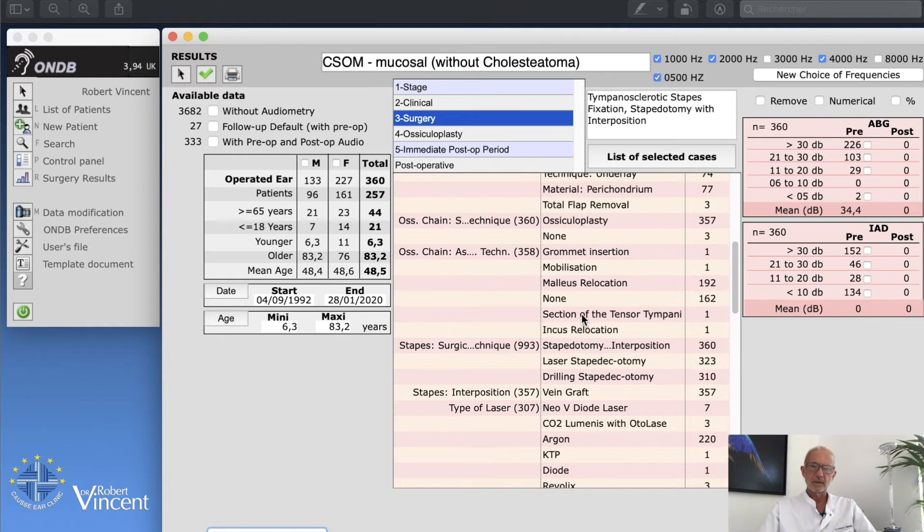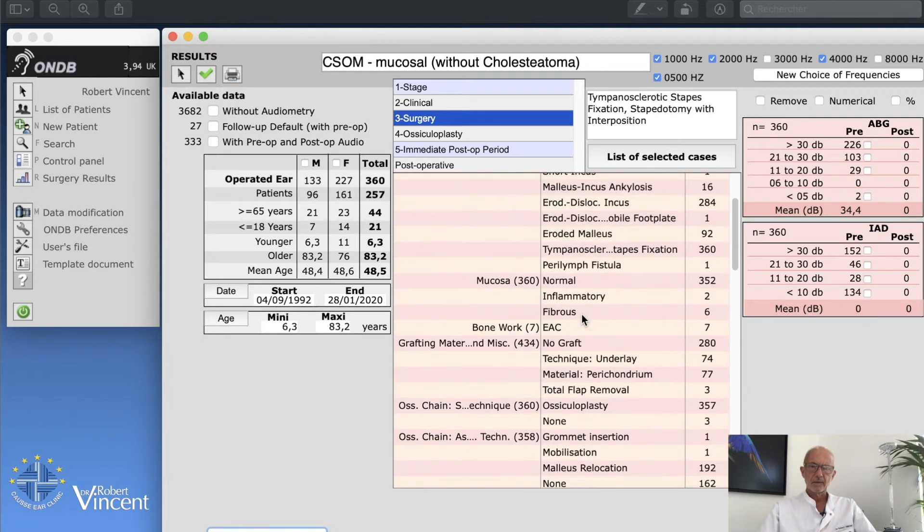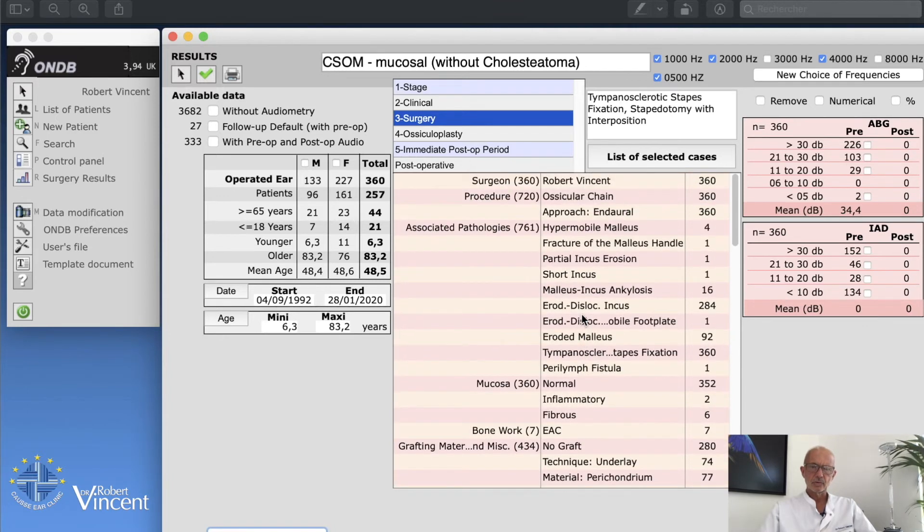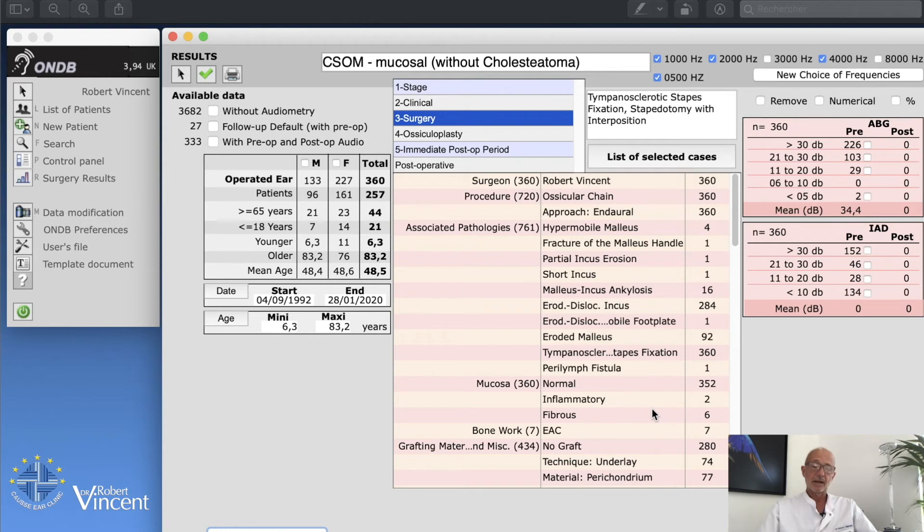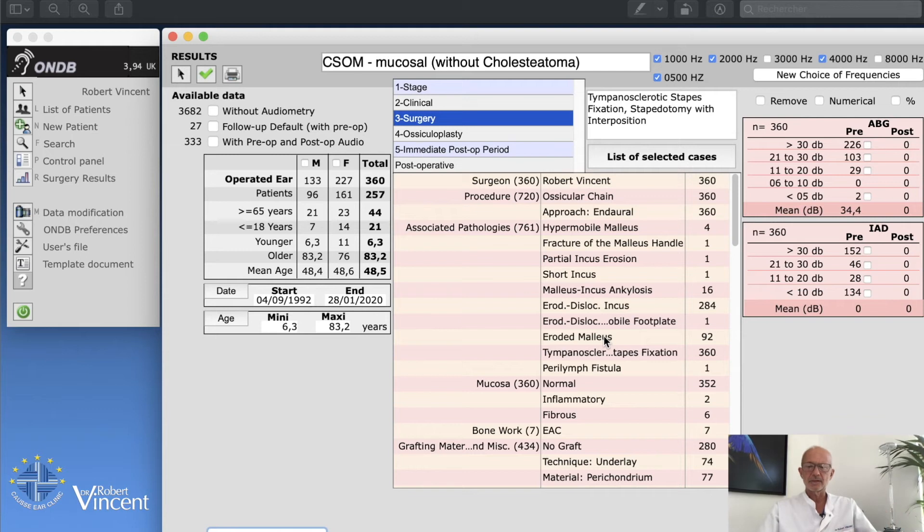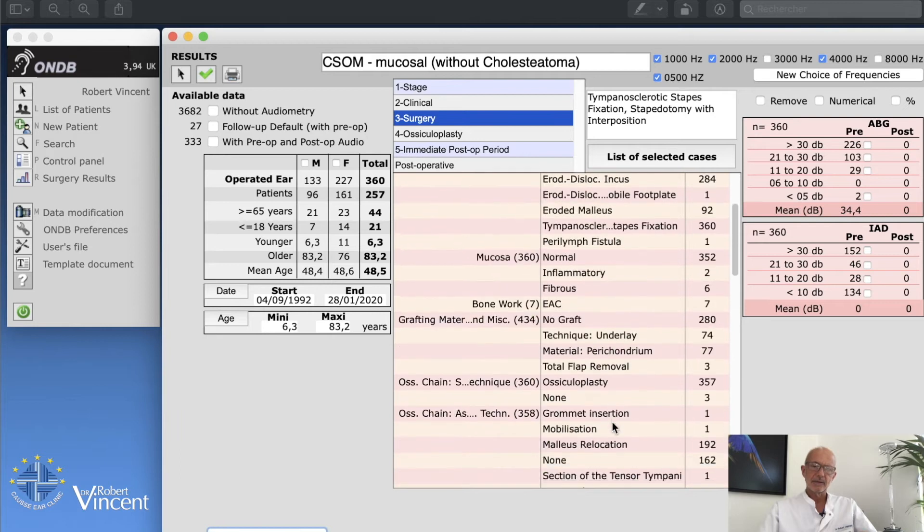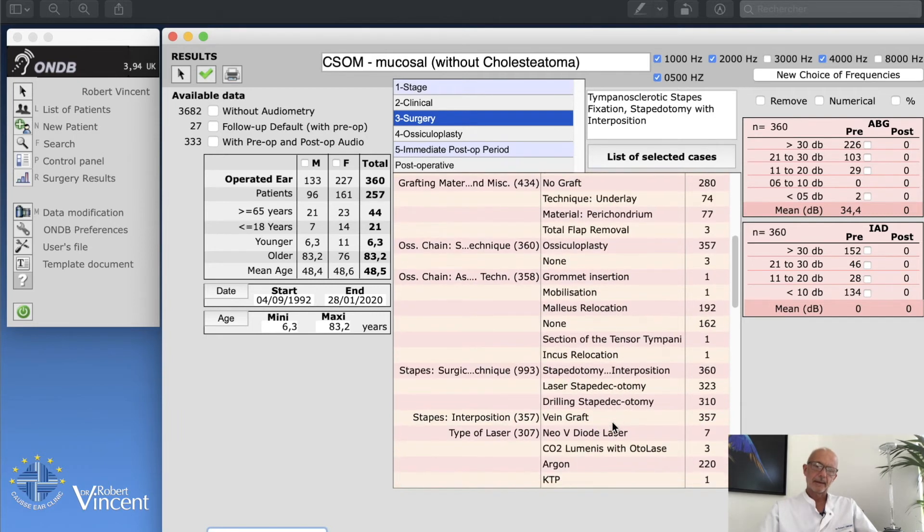If we look to the status of the ossicular chain, we have to go to associated pathology. There's a list of different things which means different things that I encountered during surgery: eroded malleus, eroded incus, malleus ankylosis, incus erosion, fracture of the malleus, etc. Of course we cannot use all these things together.